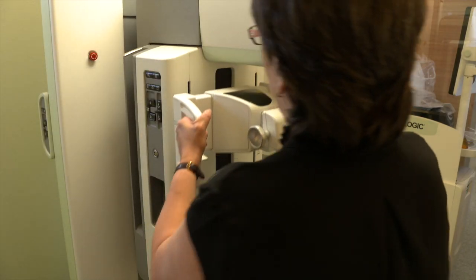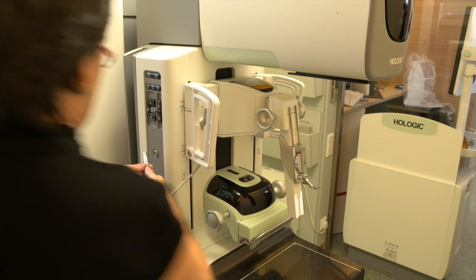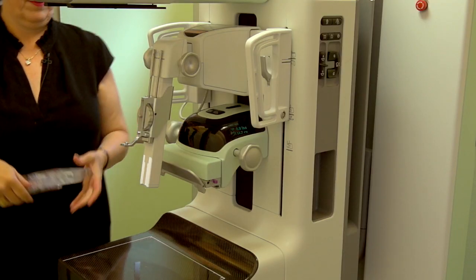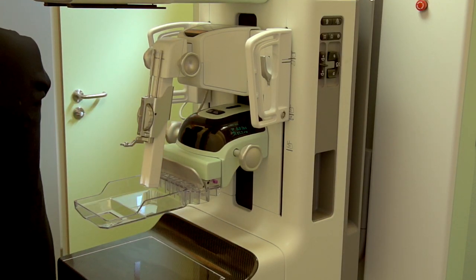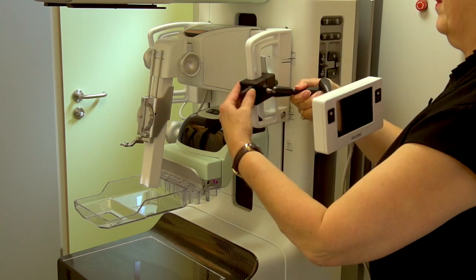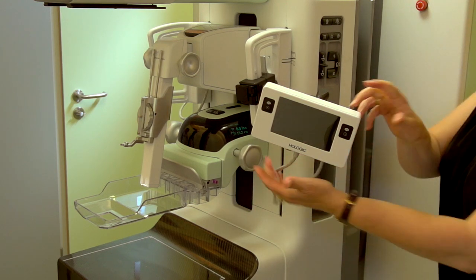The Affirm Breast Biopsy Guidance System is our solution for the three dimensions and it addresses the challenges of upright biopsy. The good thing about this system is we can either do 2D or 3D biopsies. The 3D biopsies are much quicker and there's less radiation dose to the patient. Hologic also have a lateral arm solution which fits onto the Affirm system and accesses challenging lesions in very small breasts.